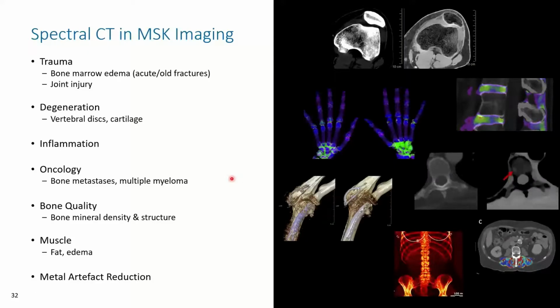But if more information is needed and further imaging is needed, then it's more time to the diagnosis. It's more scanning that the patient needs to go through. Some patients have contraindications for MRI, and the possibility that if a patient is being scanned with CT anyways, or the MRI isn't available, that we can get similar diagnoses from CT is really attractive.